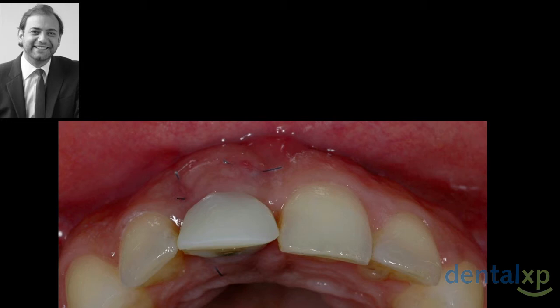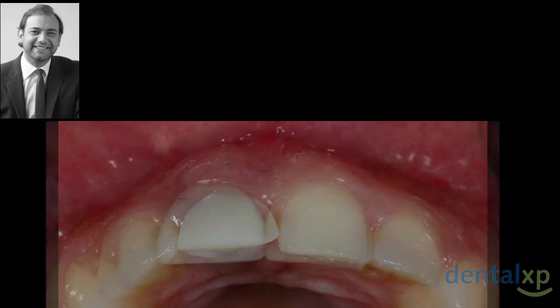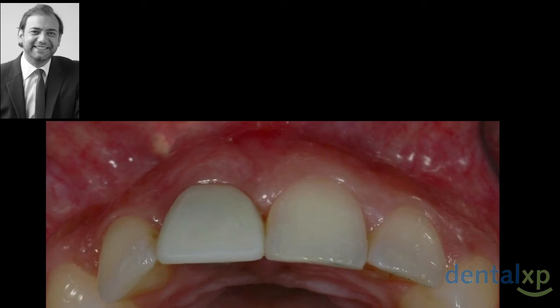We know from orthodontics that when we have proclined teeth and we bring them back to the palate, we might end up, or we will always end up, with soft tissue coming more coronally, and sometimes even with a gummy smile, which is not even nice. It's exactly the same principle, because we give to the soft tissue the mobility and space to grow in. So after this, we have more tissue.